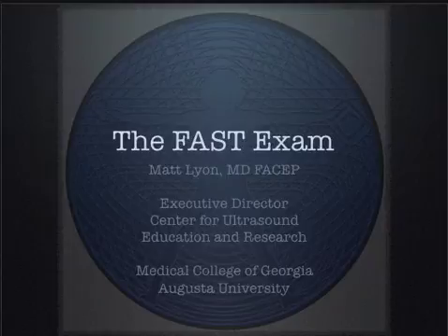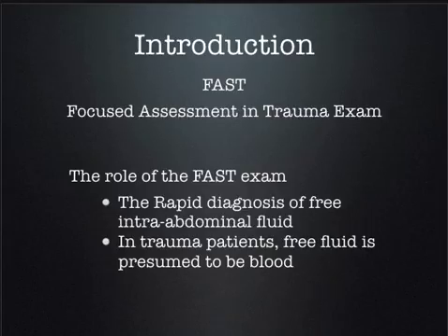All right, so let's talk about the FAST exam, okay? The FAST exam is a protocolized way to look at the abdomen. Now, it was originally described for looking at the trauma patient. That's why it's called the Focused Assessment with Sonography in Trauma exam. But really, it's just a way to look at the abdomen.